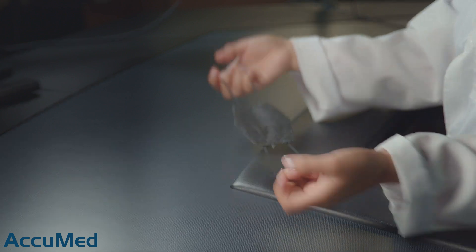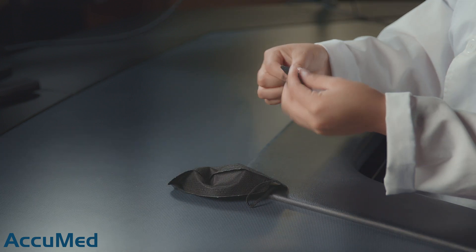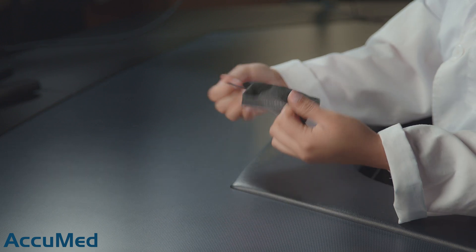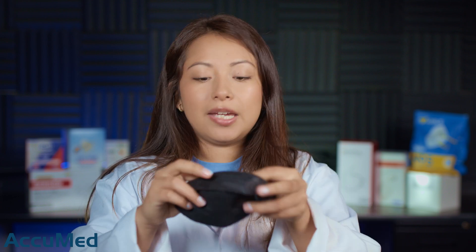Let's take a look at the straps. Let's take a look at the two other ones that we already tested. So not the best quality so far. I'm going to get a fourth mask and we are going to put it on. These are a kid's size mask, so they could be a little on the smaller side for me.